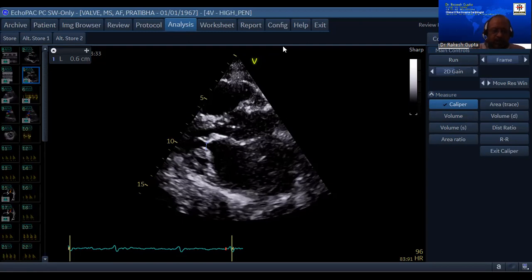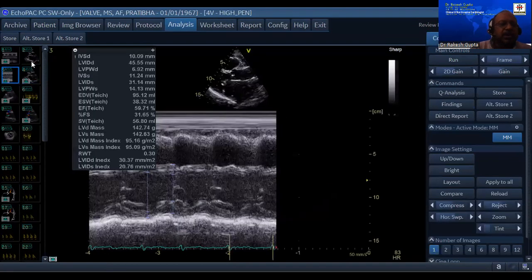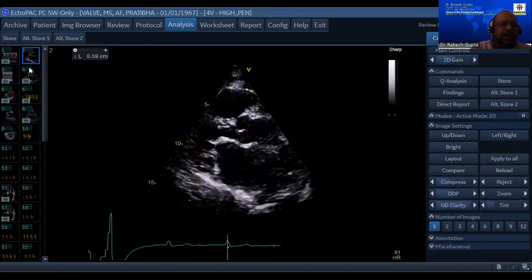All right, Dr. Vasudev Utpat. Yes, sir. Good evening. What is the next feature of mitral stenosis, Vasudev? In the same PLAX view, we can go for M mode, in which we can see the AML and PML moving in the same direction, as well as the EF slope going down. Great, good answer. M mode, and these leaflets going in the same direction.